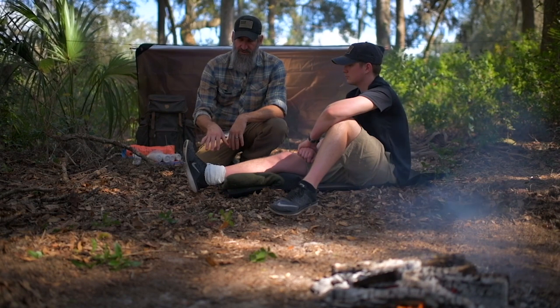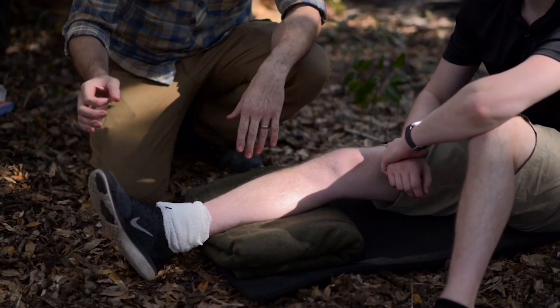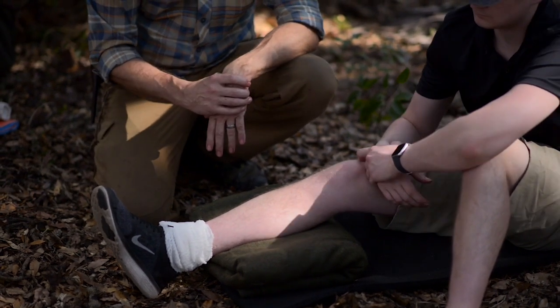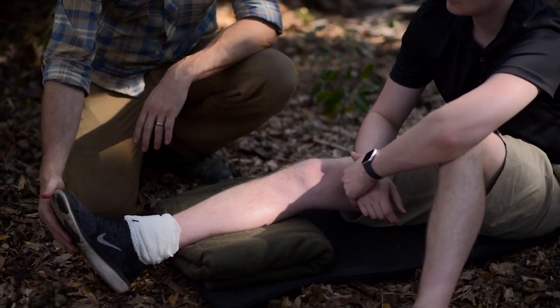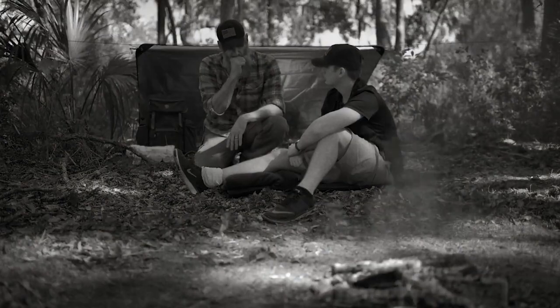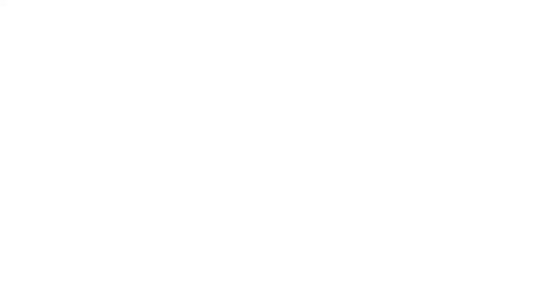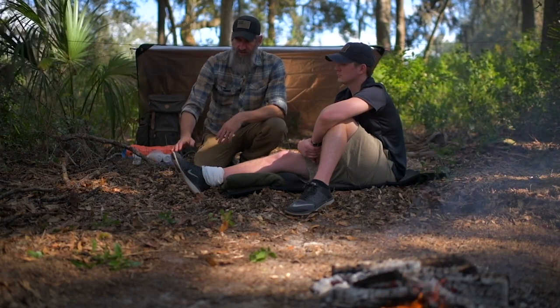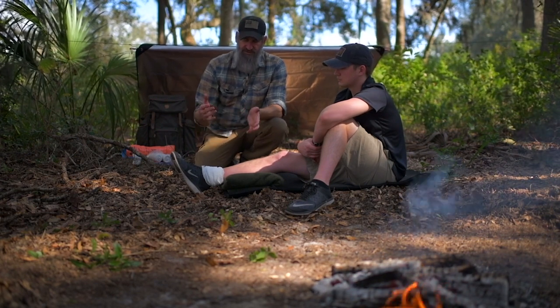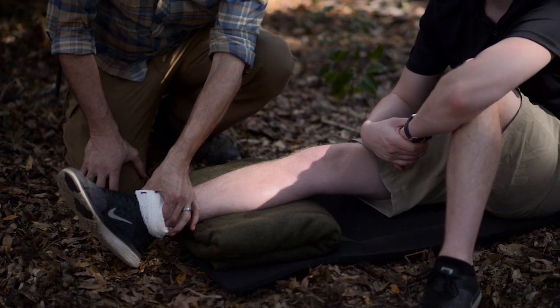The splint also needs to be accessible for checking what's called CMS — Circulation, Motor, and Sensory. For circulation, the easiest thing is to check capillary refill. Because this is a remote wilderness emergency, he still needs to walk out through whatever terrain you came through, so we're going to leave the footwear in place whenever possible to protect his feet. If you can't check capillary refill, you can also check pedal pulses — research those now before you need them.